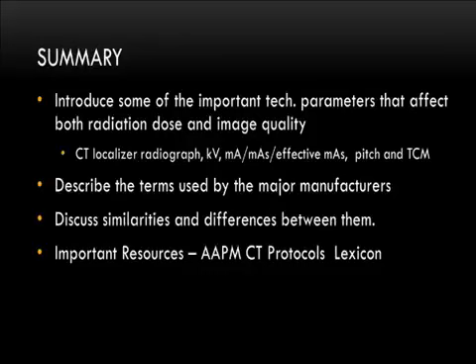So I think I heard the question right: for Siemens and their CareDose product, the reference is based on a 70 kilogram patient. But the actual estimate of the patient size is based on the CT localizer radiograph, or the topogram in Siemens. So that's going to make the adjustments to say this is a larger patient, we need to bump the mAs up.